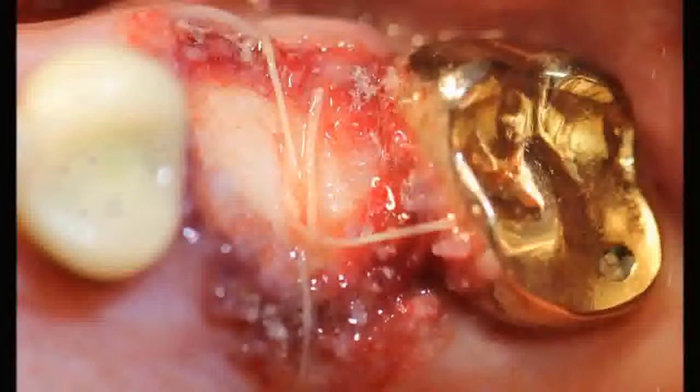The Periacryl has really improved our technique — it's made it a lot easier to apply the socket seal. The bond is absolutely superior rather than just suturing. Patients sucking on straws or cigarettes are unable to remove any of the graft material with that motion. Also, when patients inadvertently eat in the area, the socket seal is not depressed into the socket, and we're getting a much better healing result.